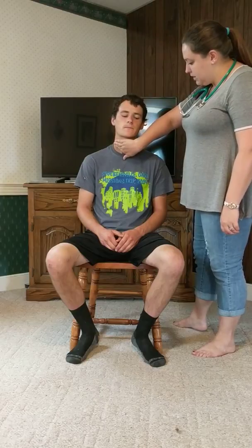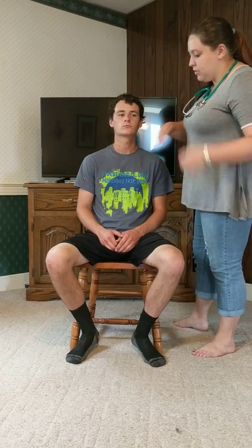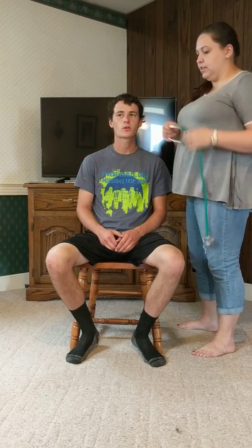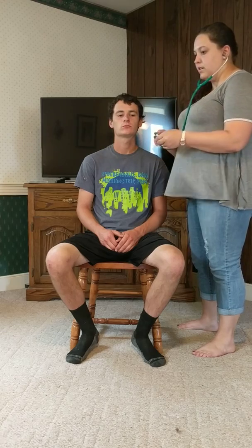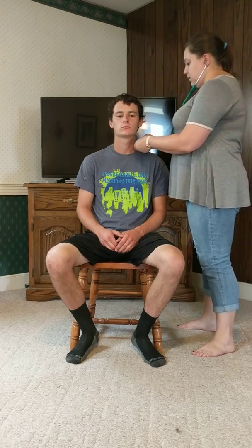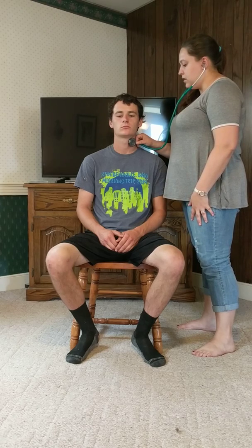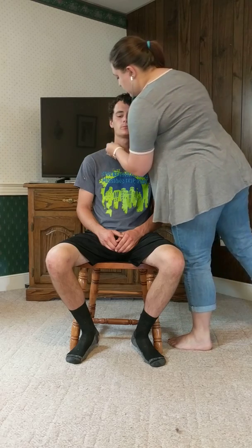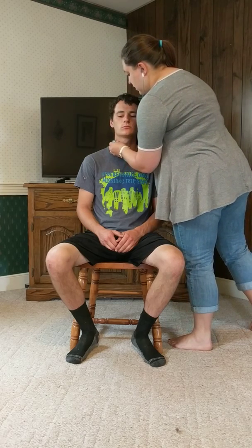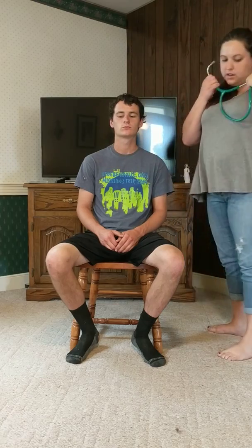And the right. That's the same, no thrills felt. And now I'm going to listen for any bruits. Okay. And no bruits were heard.